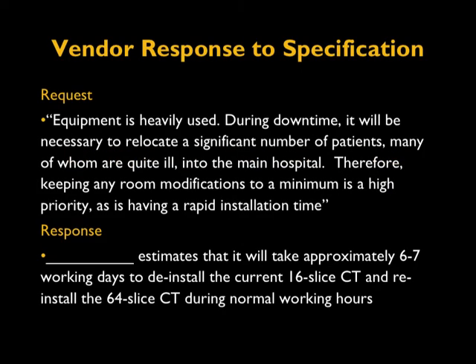So for example, here is a request in the specification: equipment is heavily used and during downtime it will be necessary to relocate a significant number of patients to a different hospital. So one of the requirements in the specification is how fast the scanner can be installed and get running.